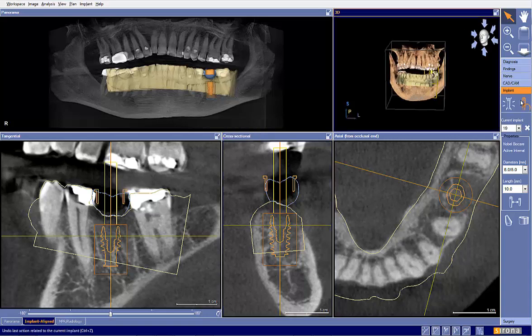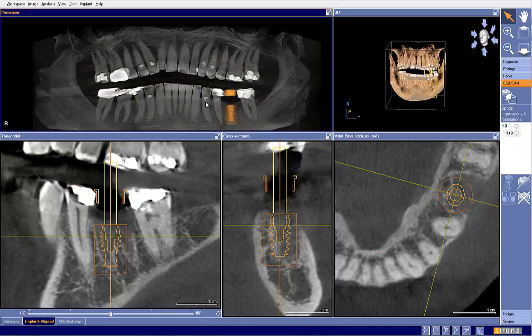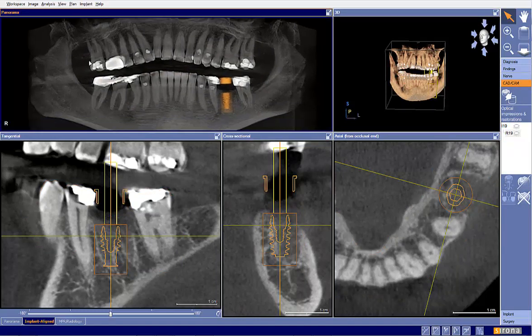So this case, the first question I always have when we look at a case is, what type of guide is this going to be? Is this a classic guide? Is this an opti guide? This is certainly an opti guide. I would say we probably wouldn't use number 18 or number 31 as integration teeth, but the rest of the teeth are certainly fine, and certainly number 3 wouldn't be used either.